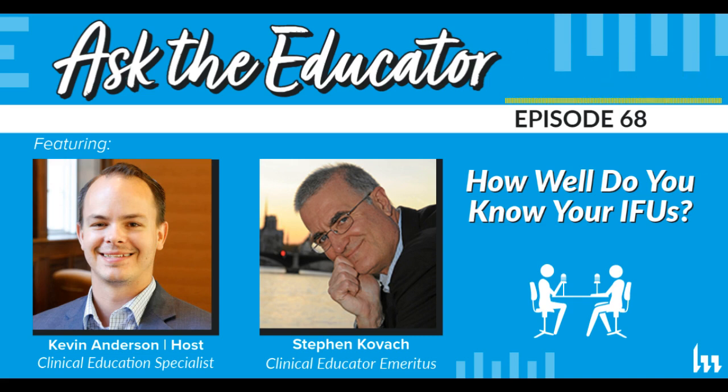But people don't read the IFU, and it gives 10 minutes of sonication. I see them at 3 minutes, 5 minutes. There's a reason for this. These companies have done a validated program. And so this gets to a bigger question, I believe, Kevin: will people really follow the IFU? They're going to say, I don't have enough people. I don't have enough time to do it the right way.